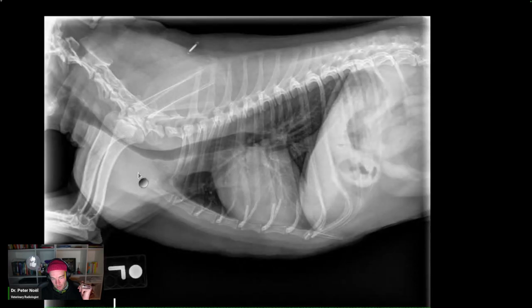The other thing that you'll get, and we'll see it on CT, is the esophagus. It'll sit over it, and the esophagus will pooch into that membrane a little bit. And so then you'll have the esophagus riding in that groove of that normally somewhat elastic dorsal membrane. And so when you get that in there, it'll create that opacification that you can't discern on radiographs very well.